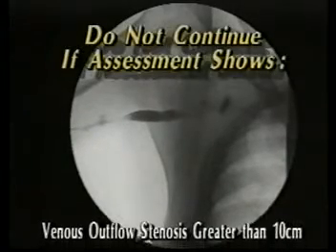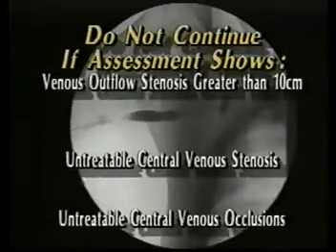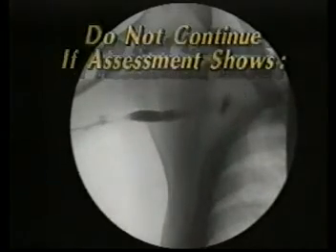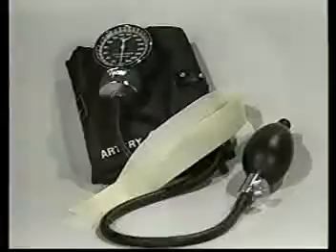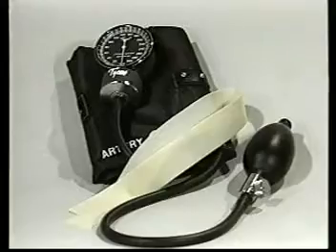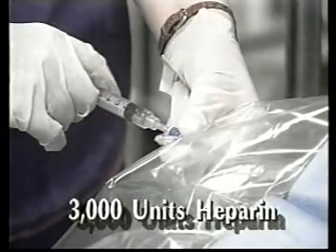If fluoroscopic assessment shows venous outflow stenosis more than 10 centimeters long, untreatable central venous stenosis or occlusions, or any large pseudoaneurysm, the treatment of the graft with PTD should be reevaluated and alternate treatments considered. In the rare instances in which there is no venous outflow stenosis, place a blood pressure cuff or tourniquet on the arm just above the venous anastomosis. At this time, administer 3,000 units of heparin intravenously.